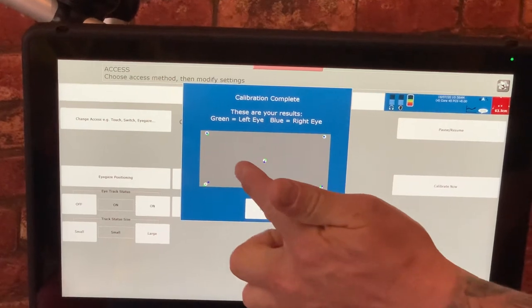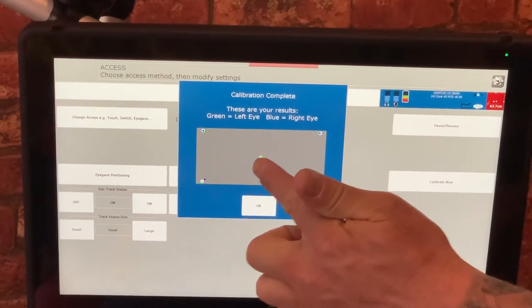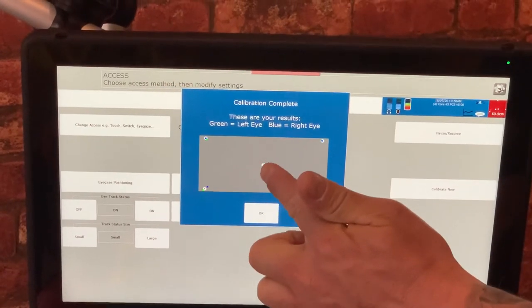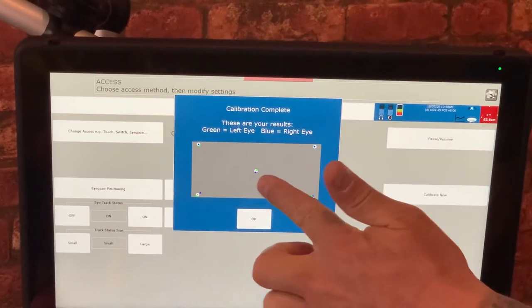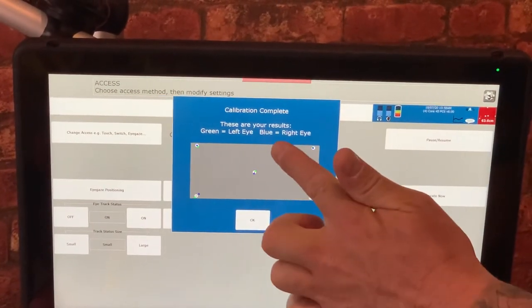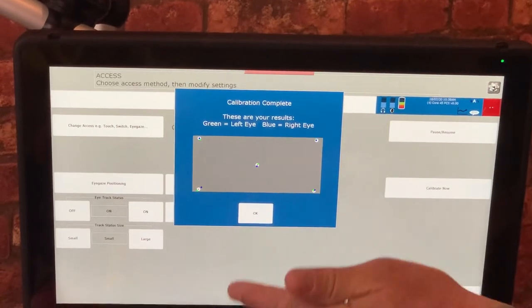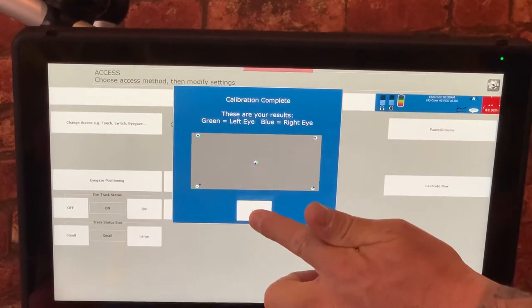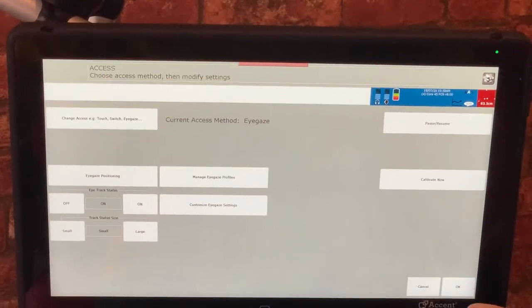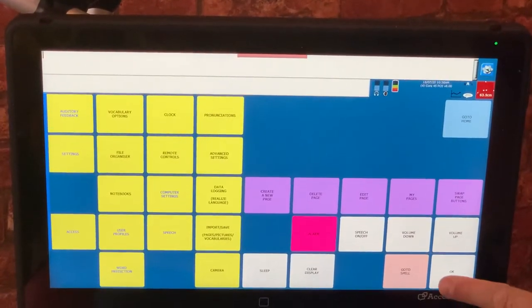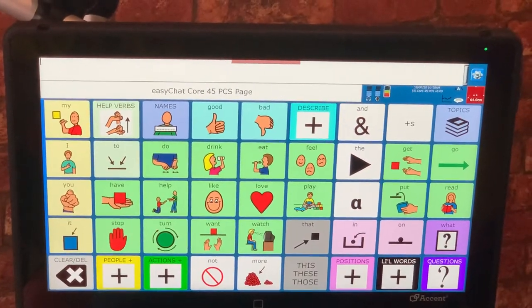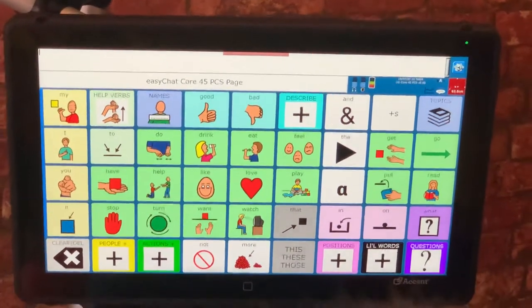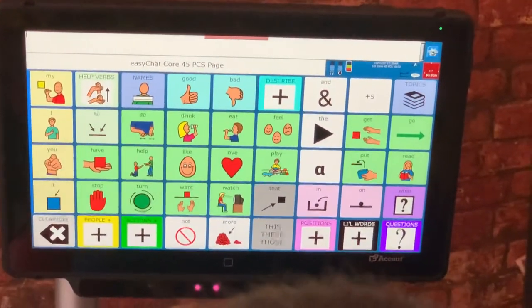It'll come up with an indicator of left and right eye to show you where they are. Left eye is green, right eye is blue. Just press OK for me, press OK again and press OK again. And we should be ready to start using eye gaze.